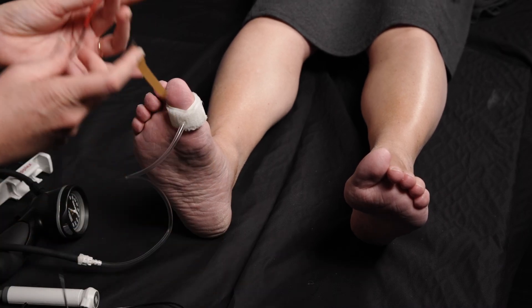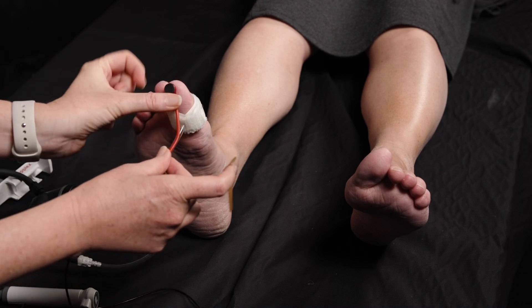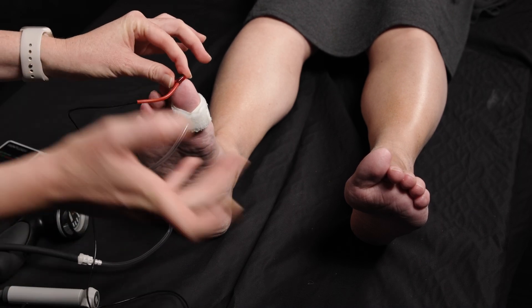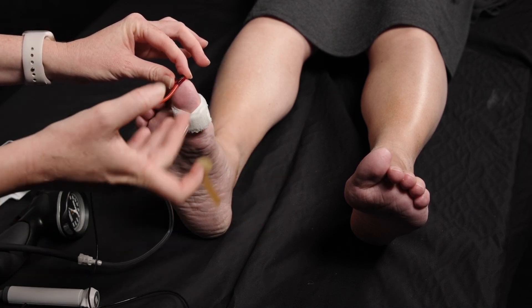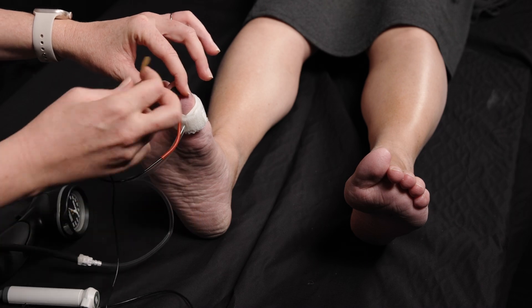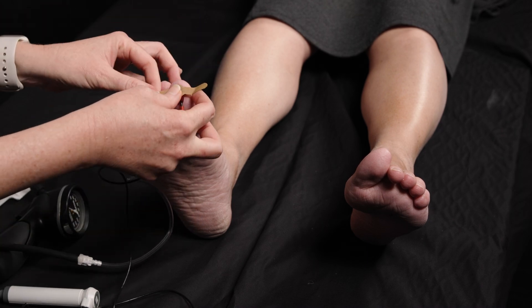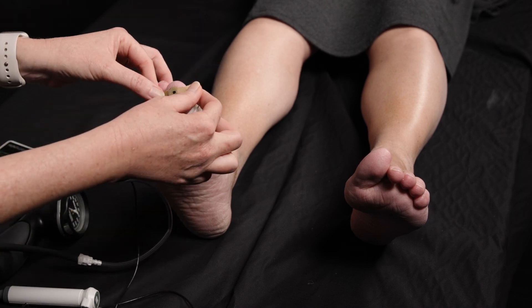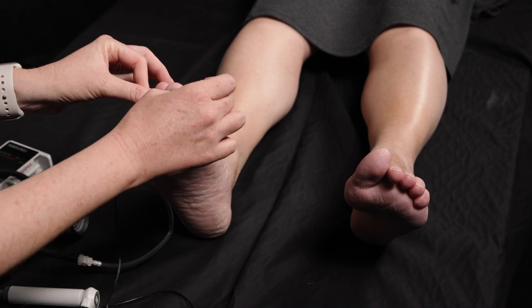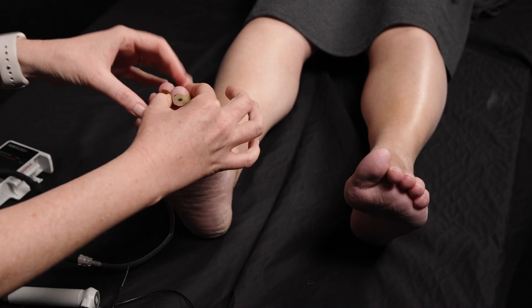That just sits flush on the toe, so not too high. If it's up too high, light will get in, so we want it to be nice and flush. We just tape that again, not too tight, but firm enough so that it's in full contact with the skin.